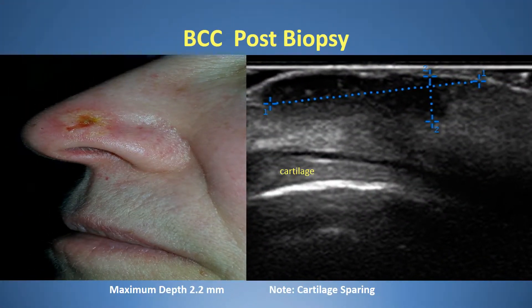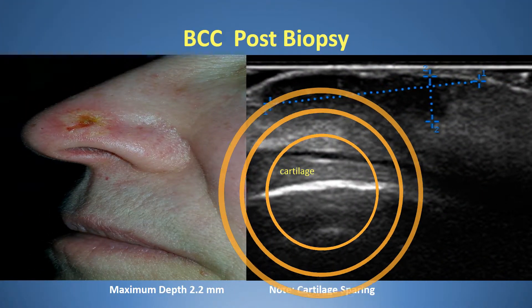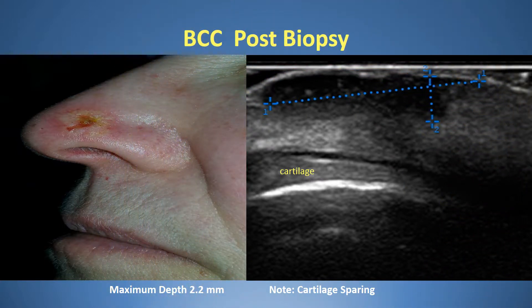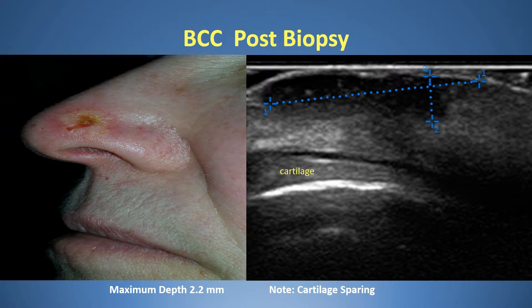Here is another basal cell. Notice the white line in the area labeled cartilage. We were able to tell this patient with a large tumor that the cartilage was spared. So even though there is a significant problem, having this quality of imaging helps to know that the problem isn't worse.